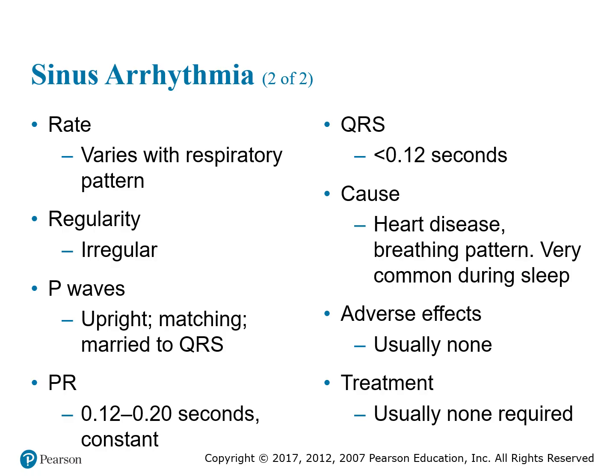Like I said, it's associated with people who breathe. If you watch your own heart rate, it actually does that too. When you take a deep breath in, you'll speed up a little bit, and when you breathe out, it goes down a little bit. Very prominent in children, though. You'll see that a lot of times in kids. A 6 or 7-year-old kid will come in and you'll be doing an EKG, and you hook them up to the monitor, and the heart rate may vary 10, 15 points, and the kid's sitting there with nothing wrong with them at all. But as they breathe, their heart rate will vary back and forth.